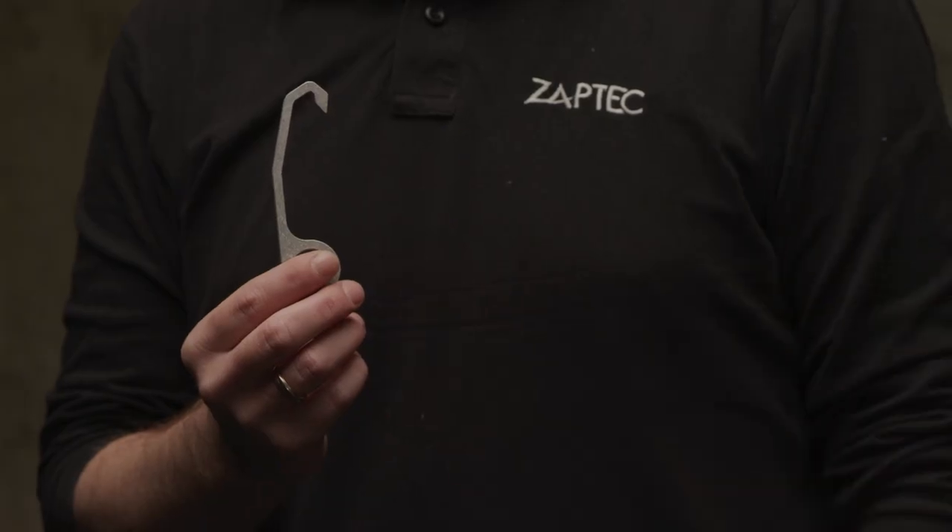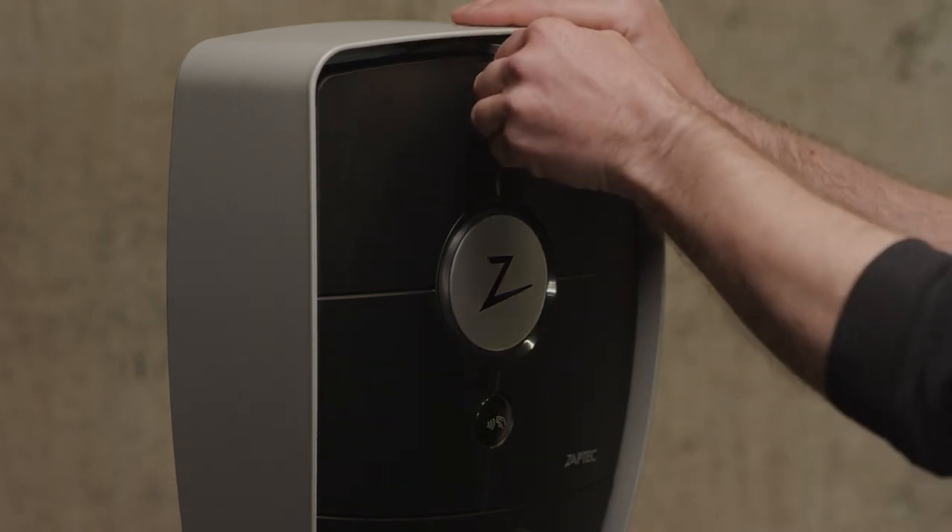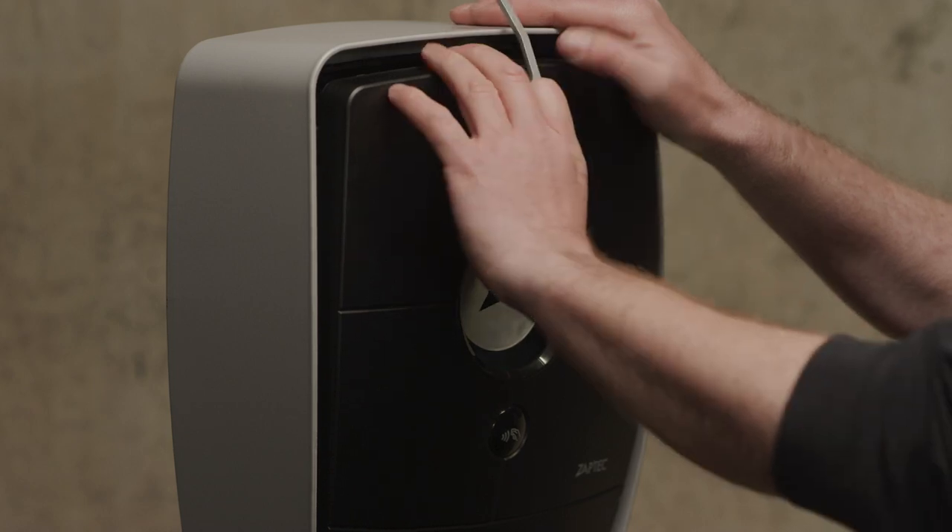Use the long Smart Key if you need to remove the cover on a column. Pull the Smart Key towards you until you hear a click. Tilt the cover off as shown here.